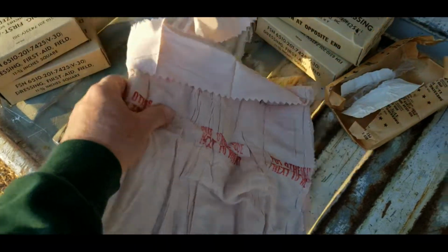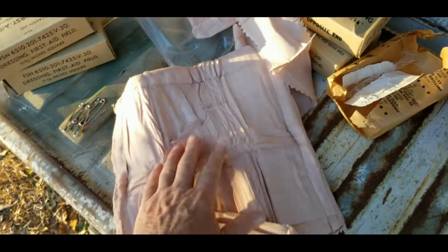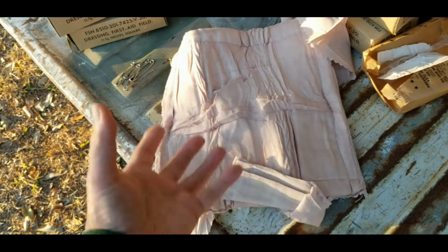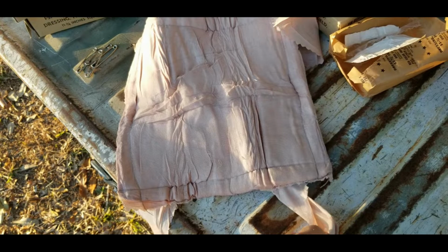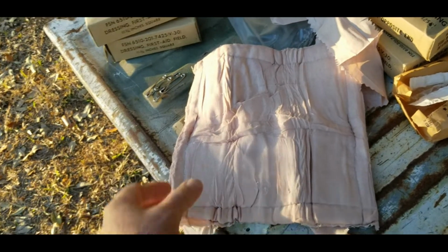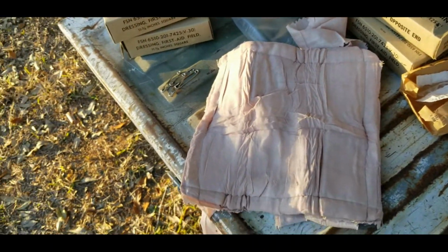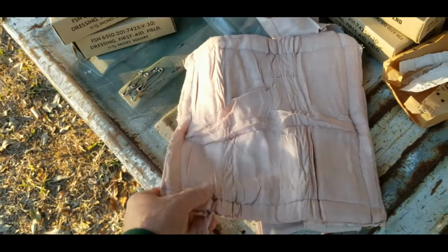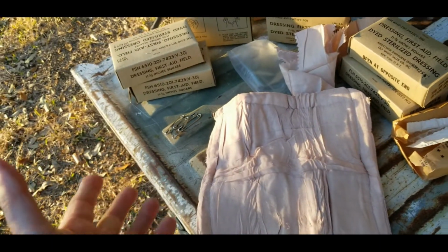Put the other side next to the wound. And, obviously, if you had a really bad leg wound, it would work good for that too. This is going to soak up a lot of blood, but that's not its main purpose. Its main purpose is to put compression on that wound, and that's what these ties are going to help do. $2.99 is what I got these for, and I'm pretty impressed with them. This one I will mark as training, and I will put with my training gear, and the other 8 are going into my larger kits. Again, high quality, even if it is a few decades old.